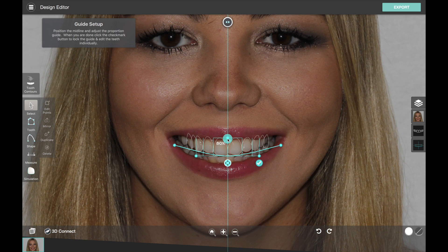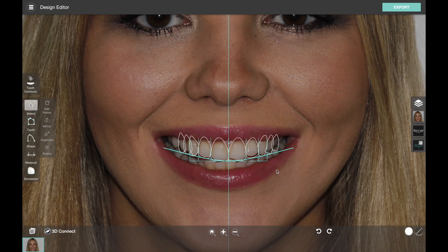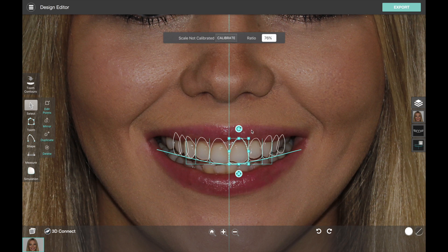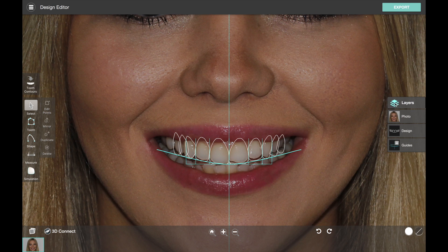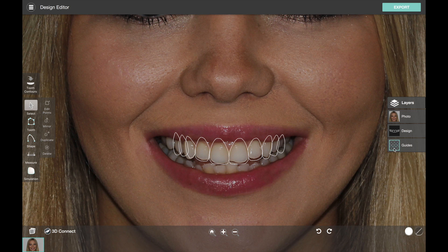If we adjust the length of the guide, we're adjusting the proportion of the centrals. Once we're happy with it we click on the checkmark button, which locks the guide and unlocks the teeth so we can edit them one by one. Now the teeth are enabled for editing and I can select them individually and make changes. If I want to get rid of the proportion guide I have a layer editor on the right side of the screen, which lets you toggle on and off different groups of content or layers in the design. The guides layer shows that it's locked — clicking it will hide it, and clicking again brings it back unlocked. There are three clicks to cycle through all the different states.